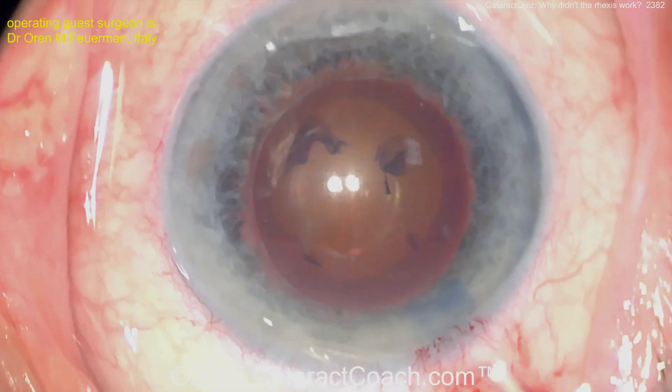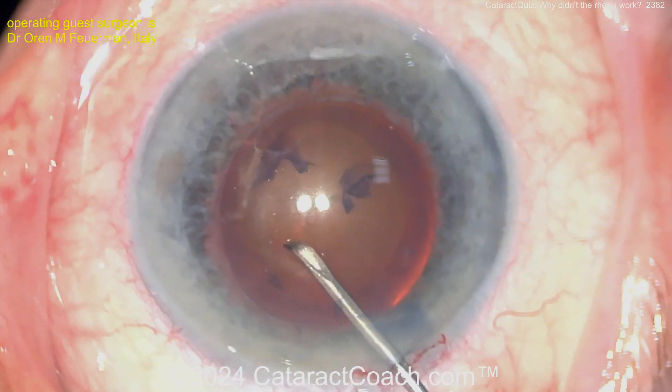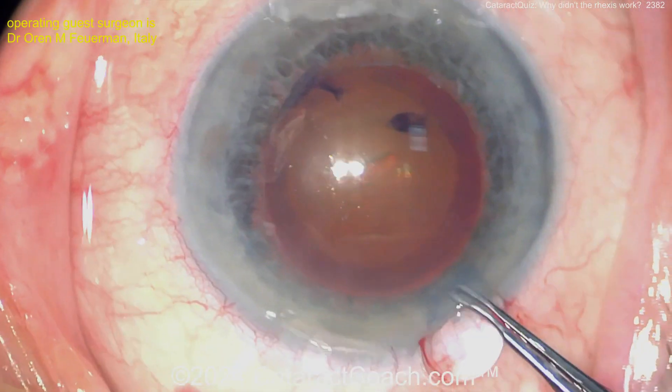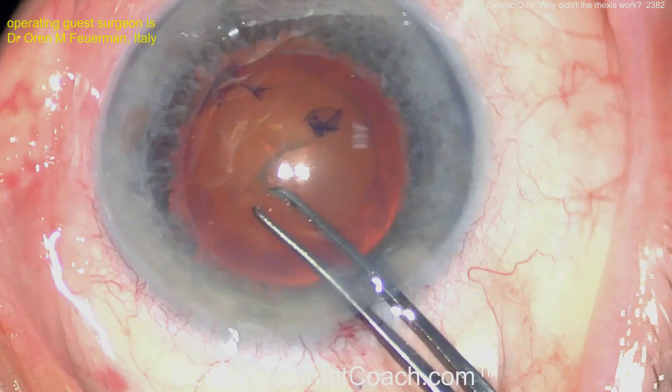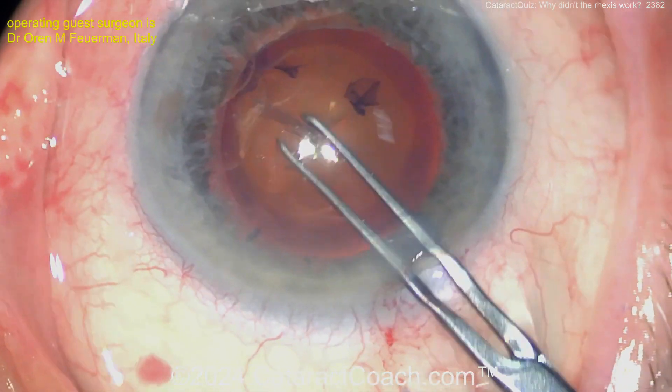Hydrodissection — you try to hydrodissect, but look, you can't. That was a second capsule. Now poking in again to get the capsulorrhexis done on that second layer. So is this true exfoliation of the lens capsule, or is the lens capsule split in half? It's a split lens capsule — you did one capsulorrhexis and now you've got to do a second one.